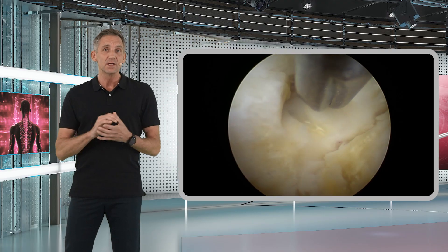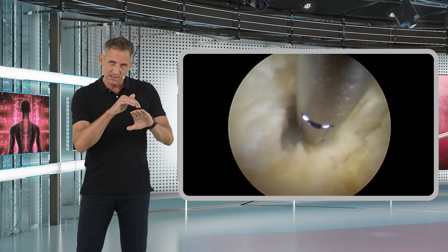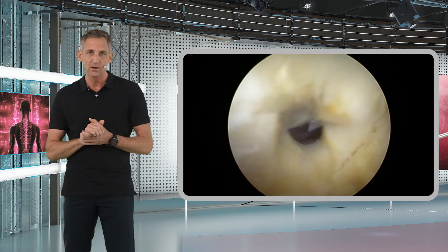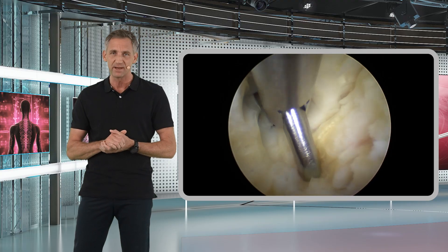what you can also do is take the scissors and use them like a dissector through this last layer. You can go through this last layer of the yellow ligament bluntly, and this can be done very safely.